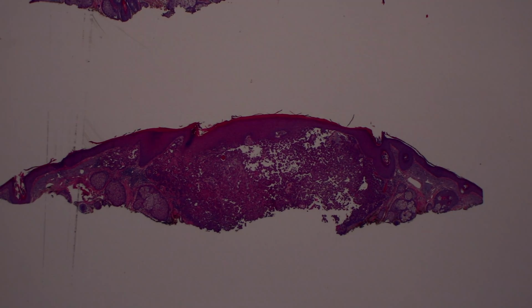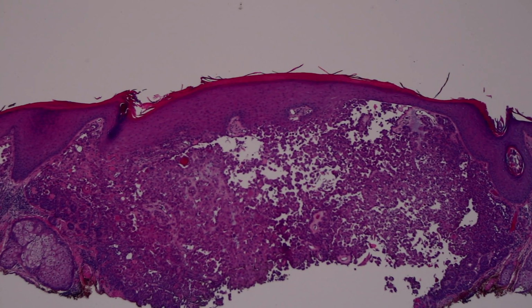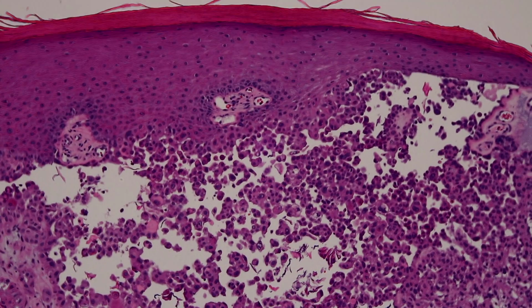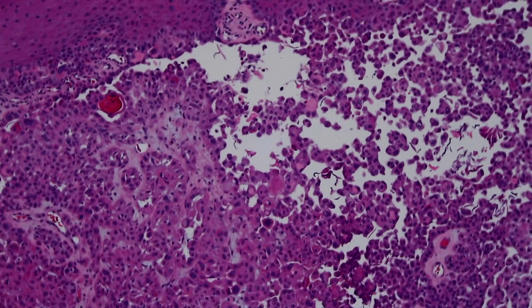Here, this squamous cell carcinoma is falling apart, and it leaves all of these open spaces. These spaces are filled with keratinocytes that are rounded up and very, very pink, and they have smooth, round borders. So this is a squamous cell carcinoma with acantholysis, or what we call an acantholytic squamous cell carcinoma. And these are important to recognize.